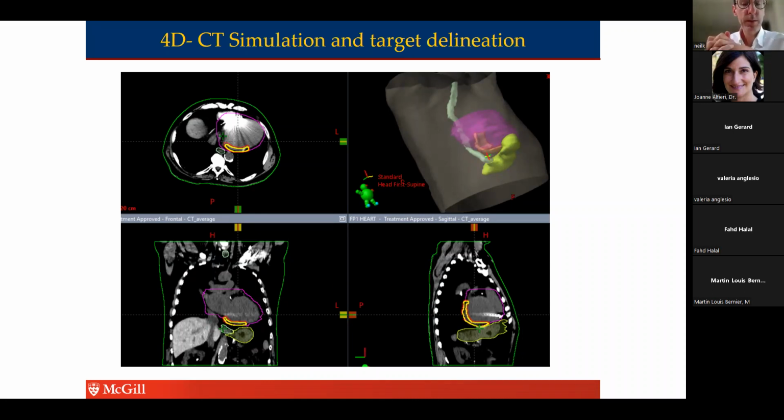to be sure that I'm drawing things out correctly. First appointment in the Department of Radiotherapy, the patient is invited to come to our department, DS1. No treatment that day. What is the first step? They need to undergo what we call a planning simulation scan. And specifically, it's a 4D CT scan. 4D, fourth dimension being time.